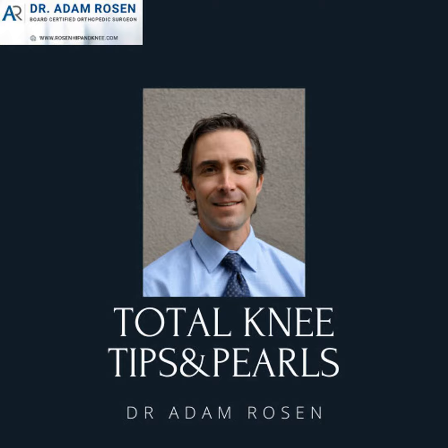If you're looking at a pelvis, or you're looking at Judet views, or if you're looking at a shoulder, did you get an axillary? Did you get a Velpeau? Did you get a scapular Y? Or was it just the urgent care AP internal and external rotation view? All of those things are important. Weight-bearing joints, the foot, if you're looking for a Lisfranc, the ankle, if you're looking for a syndesmotic disruption or ankle stability or ankle arthritis, have got to be weight bearing.